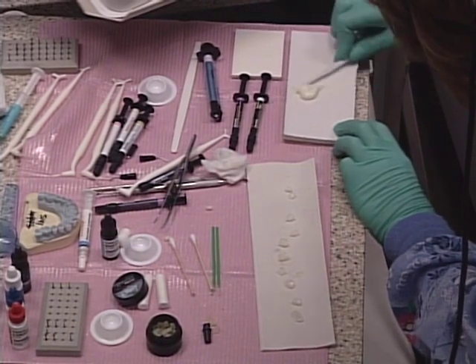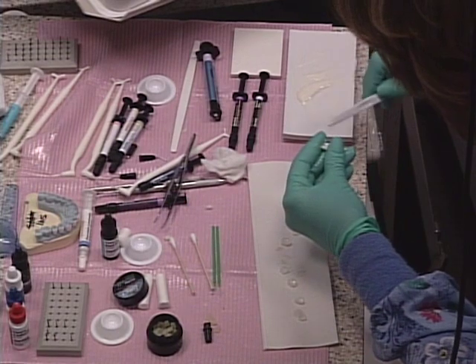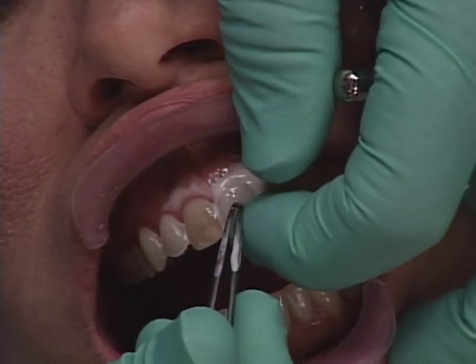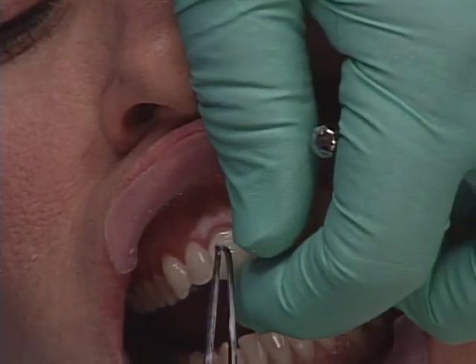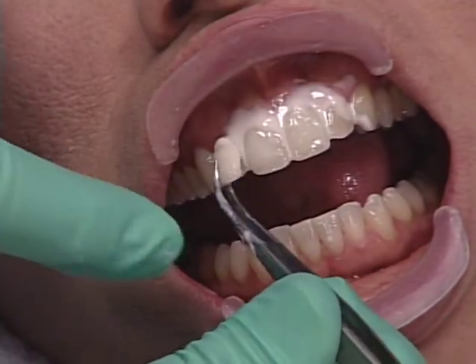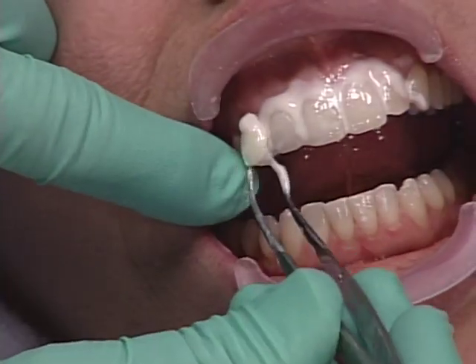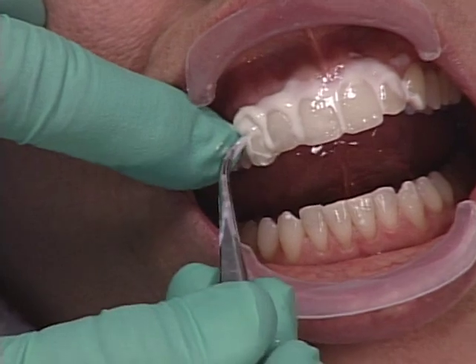So we're going to put on 8 veneers on her in approximately 1 minute. We're going to have them all set. Left central. Right central. Okay. Right lateral. And we just seat these gently to place. Right cuspid. Then we'll switch over to the left side right at this point.